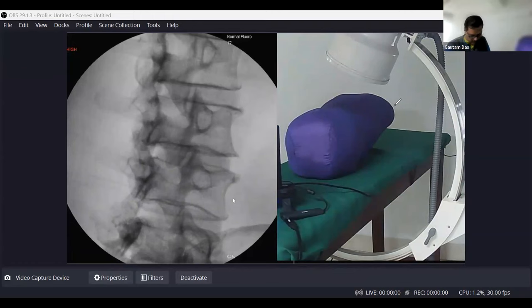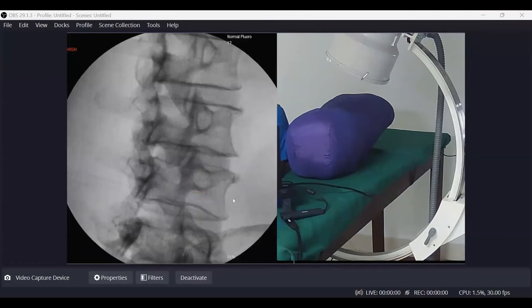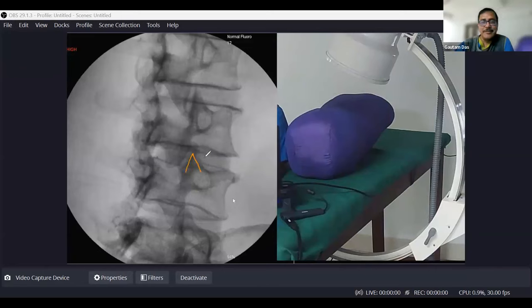Okay, so somebody was asking to explain the different parts of the Scottish dog again. So again, this is your tail. Pedicle, sir. Yes, this is your superior articular process. This should be in your mind; even when you are dreaming, you should be remembering all these different parts.